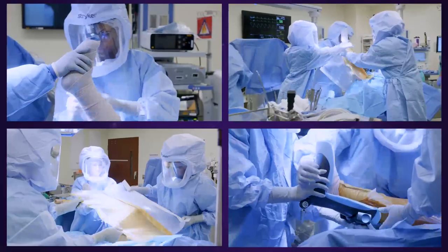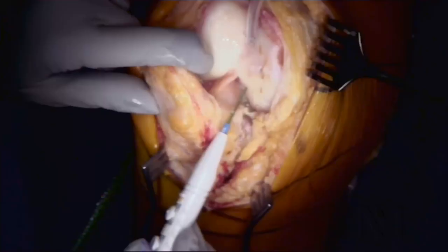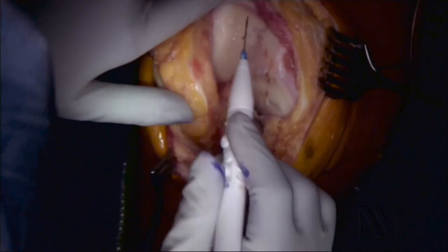So your knee is made up of three bones. You have your femur, which we're looking at, and it's pretty damaged. You have your tibia and then you have your kneecap. And at the ends of our bone, you have something called cartilage.